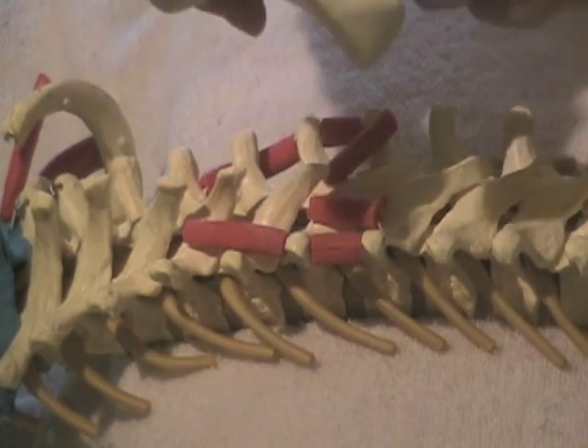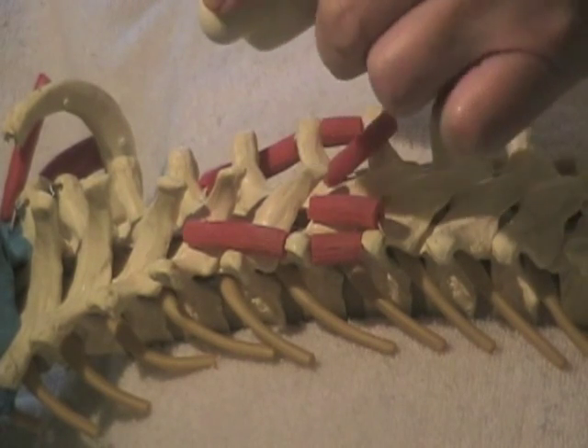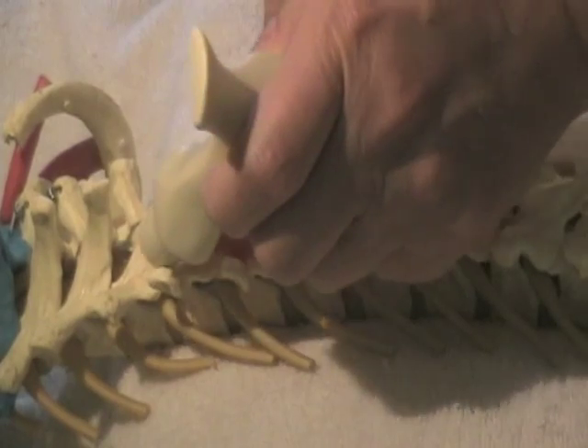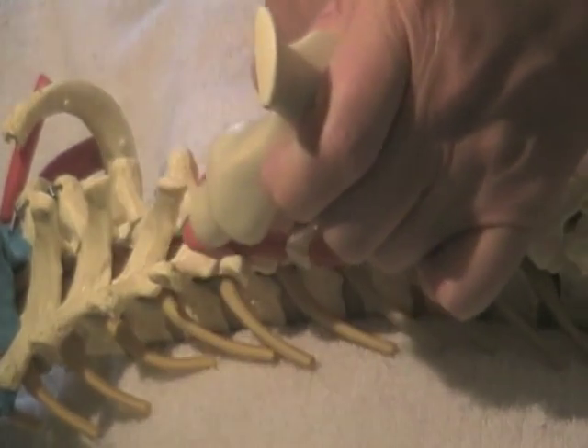You can also take the rounded part of the tool and slide it up and down right in the laminar groove. It fits in there perfectly — it's a dream to use.